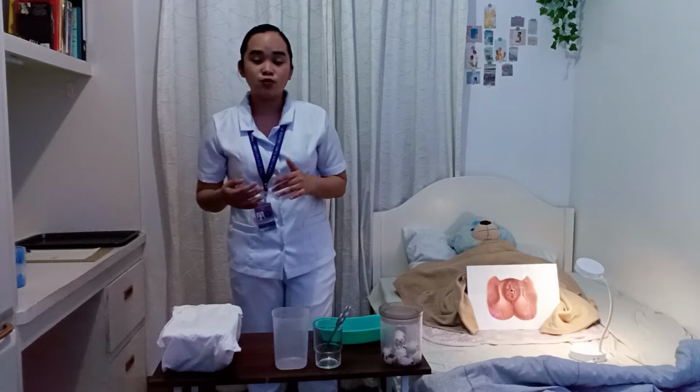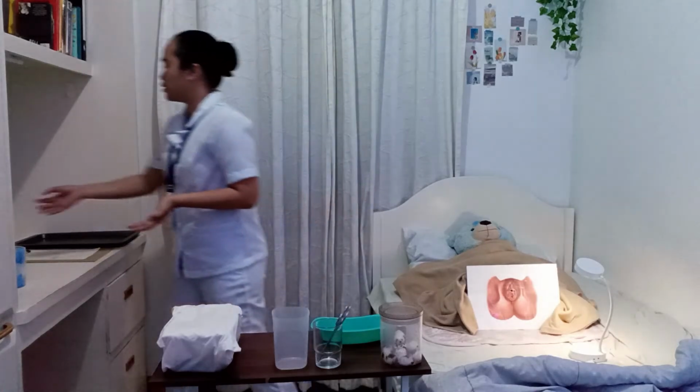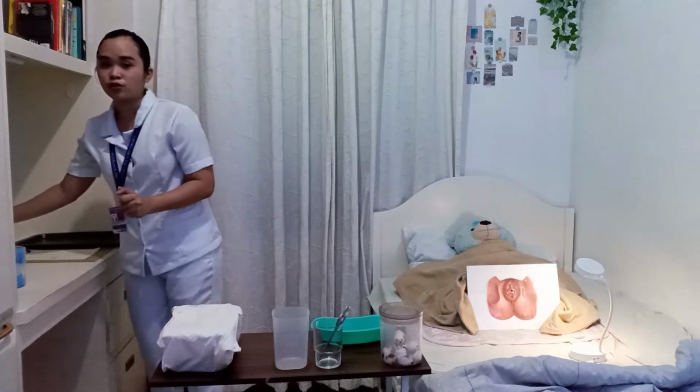So now, using sterile forceps, we're going to clean the external genitalia with the use of the cotton ball soaked with betadine. So this is done since thorough cleansing of the meatus will reduce the possible introduction of the microorganisms into the bladder. So first, I'm going to wear the gloves to protect myself and of course my patient from cross-contamination.